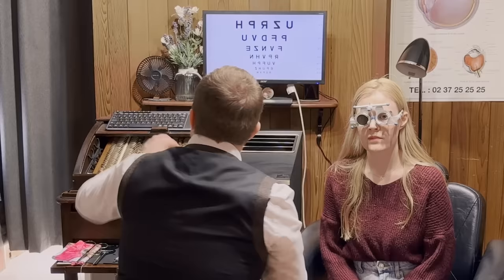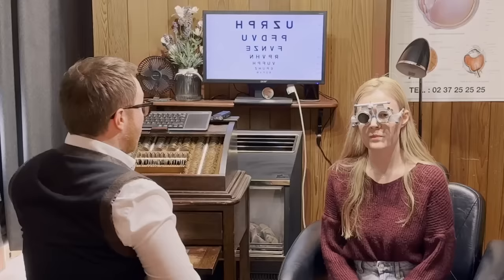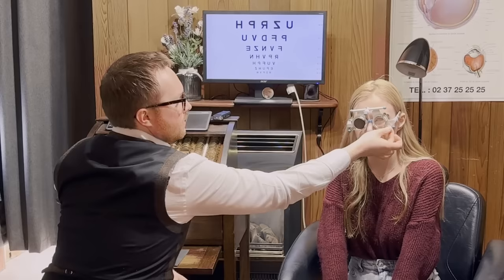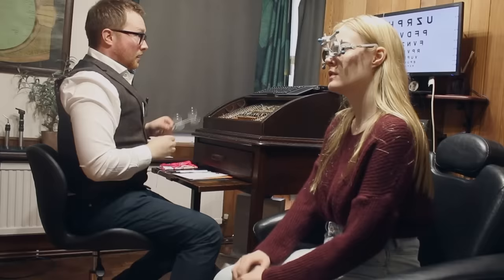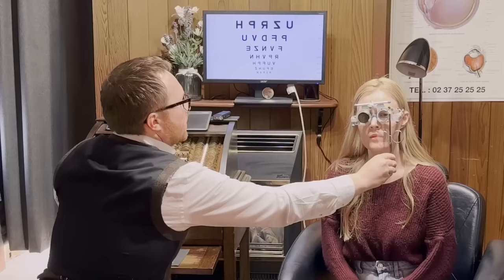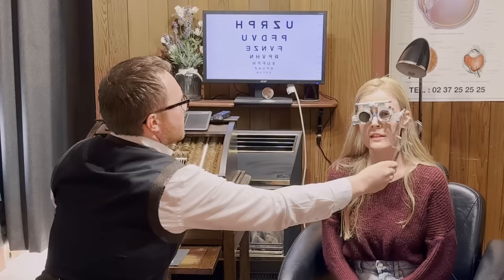Swap that lens over. And again, looking at that second line from the bottom, if I were to pop this in front, a bit better, a bit worse, about the same. That's with. That's without. I think it's better without. Okay. And if to put this lens in front, now, has it made those bottom lines clearer? Is it a bit worse or about the same? So that's with, and that's without. There's with. Without. Is this about the same? Pretty similar.